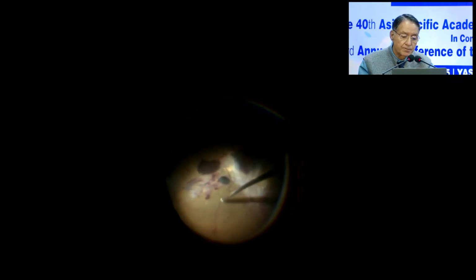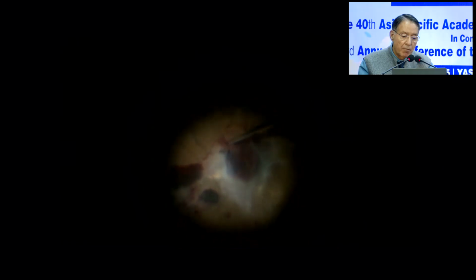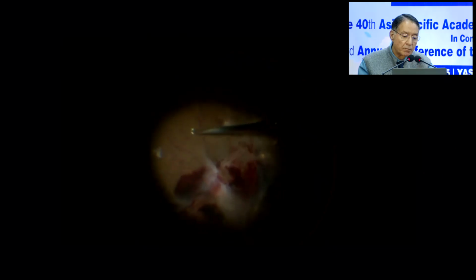In this case, despite repeated attempts, it was not possible to separate the hyaloid from the retina in the periphery. The posterior hyaloid face was then incised over an area of subhyaloid blood, and hyaloid separation extended around the disc and posterior pole with forceps and cutter. We could extend the separation radially in the lower nasal quadrant and then move circumferentially, superiorly and inferiorly, peripheral to the fibrovascular membrane.